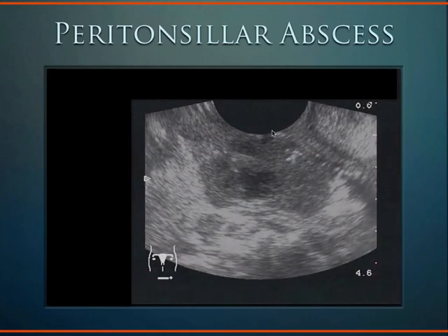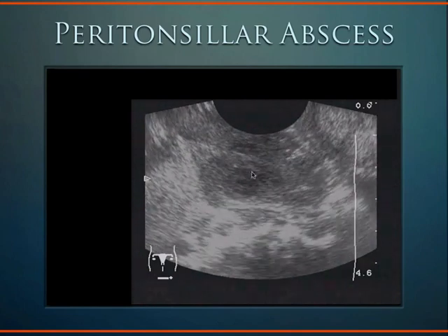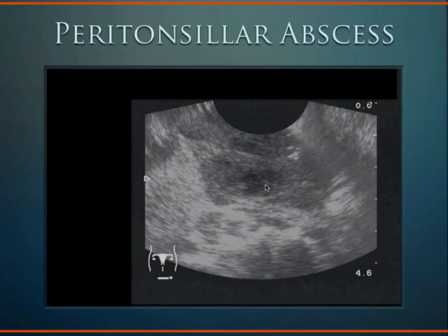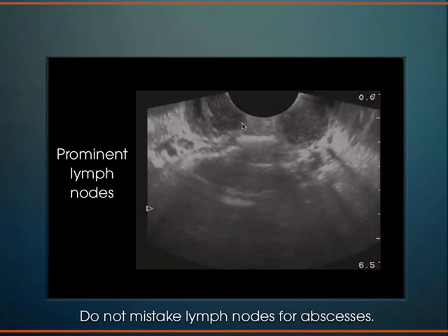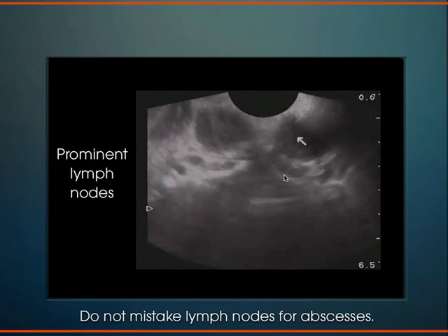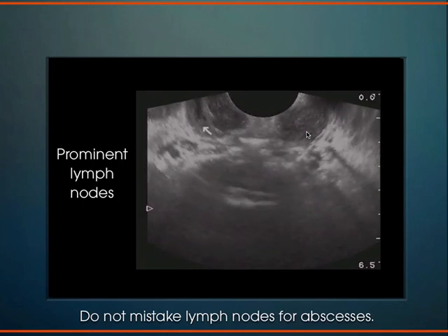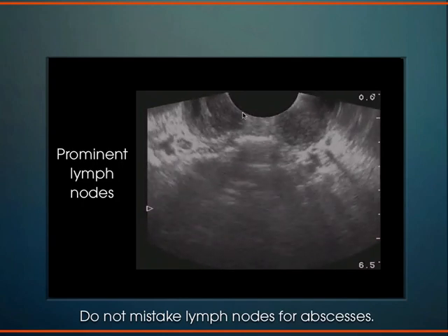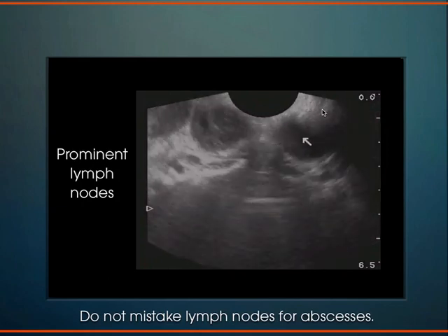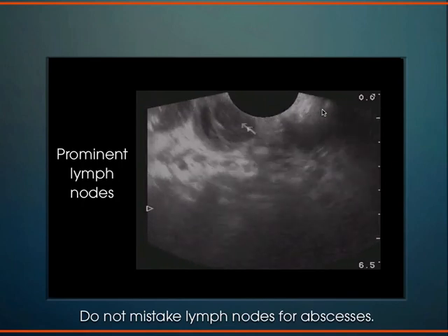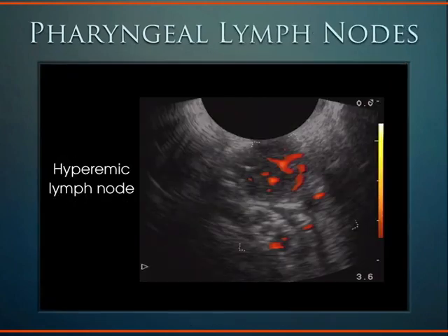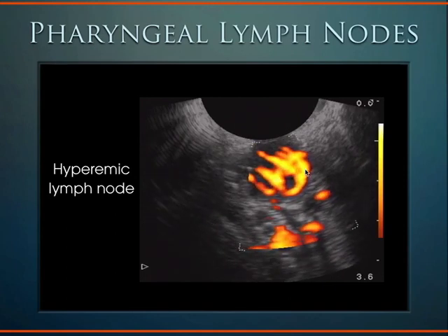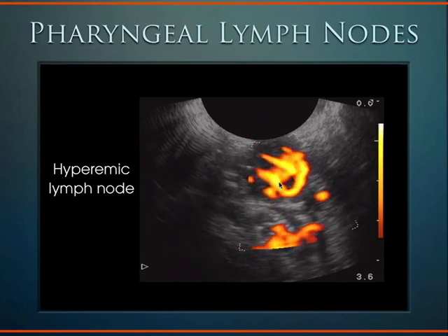This hypoechoic area here is the abscess. Sometimes you're not sure if it's an abscess — it turns out this is just prominent lymph nodes. As the patient swallows, you can many times see these lymph nodes come closer together. These are bilateral prominent lymph nodes; you wouldn't want to put a needle in those — it wouldn't be necessary. You can avoid doing an unnecessary procedure once you see pharyngeal adenopathy in the back of the throat. To confirm this is a lymph node: lymph nodes can be quite vascular, and this hyperemic lymph node seen with power flow Doppler confirms it's a lymph node and not an abscess. An abscess would not light up with power Doppler.